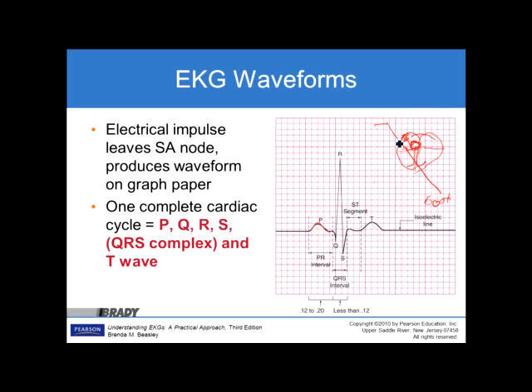And this is going to be a dark blue. The wave starts here and heads in this direction. And since it is headed towards a positive electrode, the P wave is upright or above the isoelectric line. The Q wave, just for a split second here at the AV node, we can see it actually turn into the left and right bundle branches at the His-Purkinje level. This turning looks like it's turning away from a positive electrode, or swooping just a little bit to the negative.